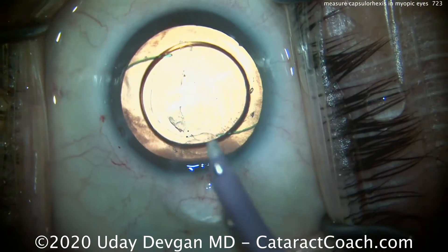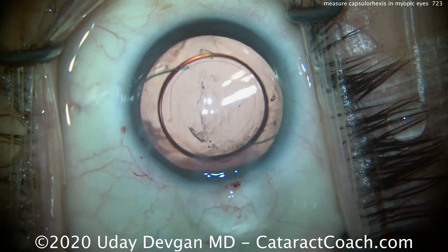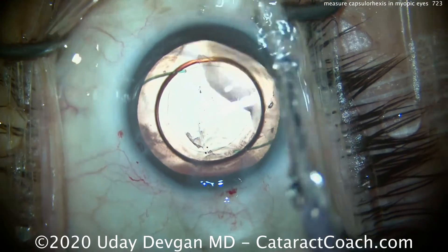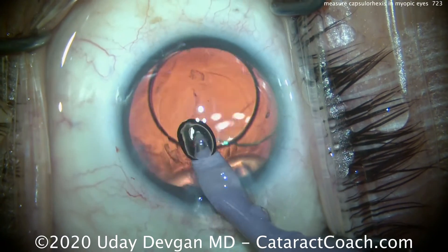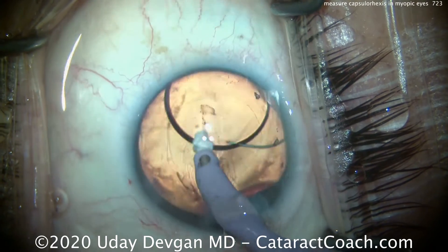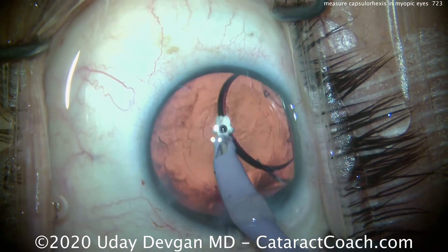There you go — you can see the lens. Even though the IOL power is so low, remember this is a meniscus lens. There's a video on that on CataractCoach — check it out. With a meniscus lens, it's very thick. Look at the thick edge of that lens. So we'll go behind the IOL optic and remove the viscoelastic from the capsular bag, and let's finish up this case.